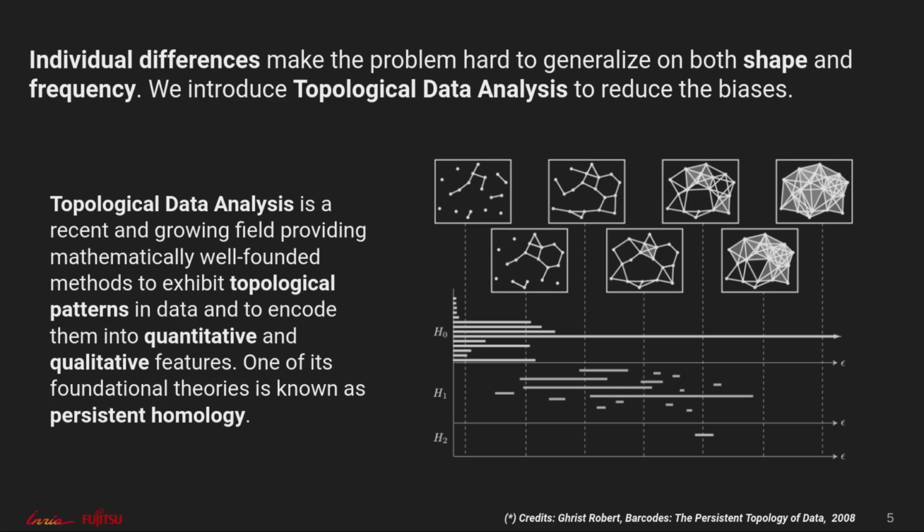of your biggest component. And these birth and death radii end up being the new 2D representation of your point cloud, either displayed in a persistence diagram where both radii are the x and y axes, or in a persistence barcode, as shown here in this example. Different dimensions for the purpose of presentation, but we'll see in the next slides where to limit our analysis. This was a basic example of a featurization through persistent homology.